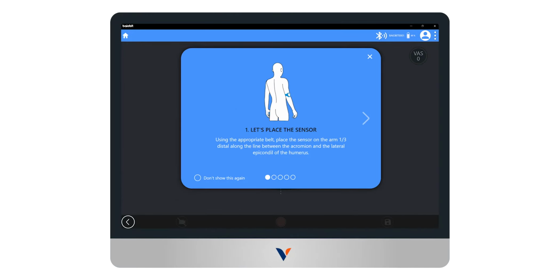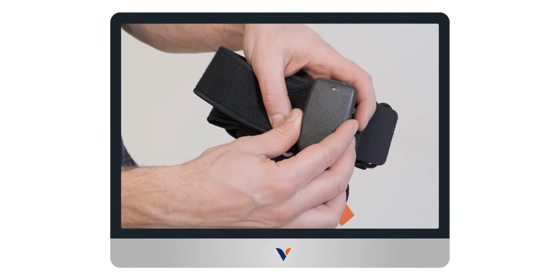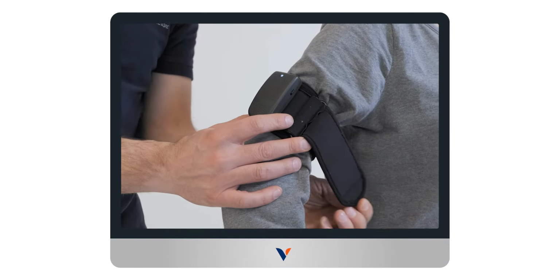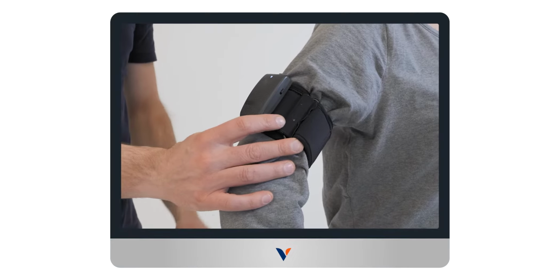As shown by the pop-up, to obtain reliable and repeatable data during the execution of the test, it is necessary to correctly position the sensor on the subject to be evaluated. For the shoulder test, the sensor must be attached to the appropriate belt and positioned laterally on the arm, distally 1/3 along the line that joins the acromion to the lateral epicondyle of the humerus.